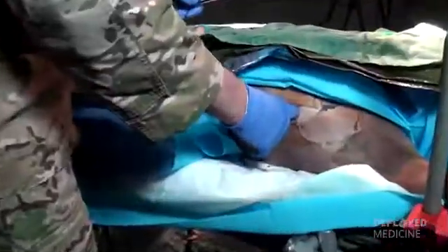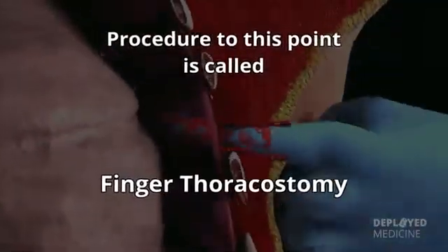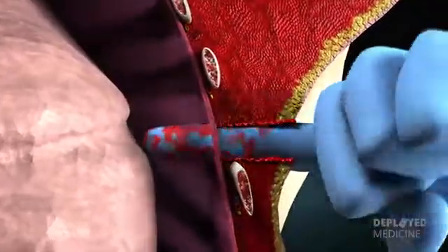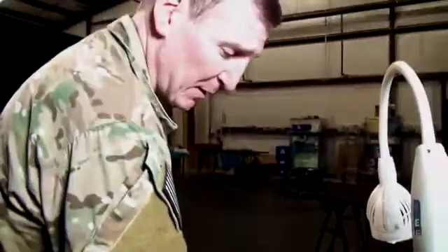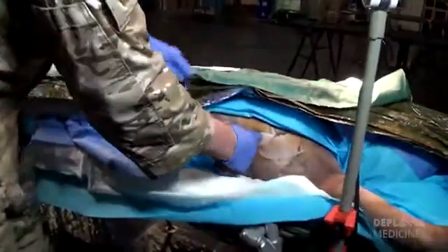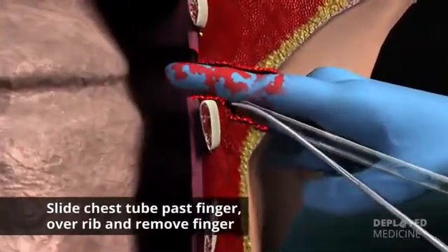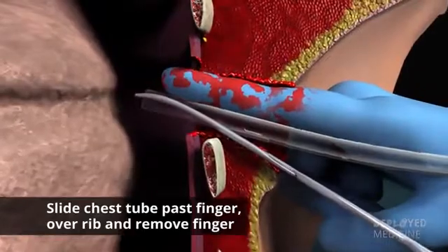This would be called, if I were just to do this by itself, a finger thoracostomy. So if I have someone who may have some significant trouble breathing and I'm not getting that relief with those needle decompressions, this may be a step that is appropriate. But here we're going to move forward with our chest tube. My finger's in. I want to slide the chest tube past my finger over the rib and into the chest.